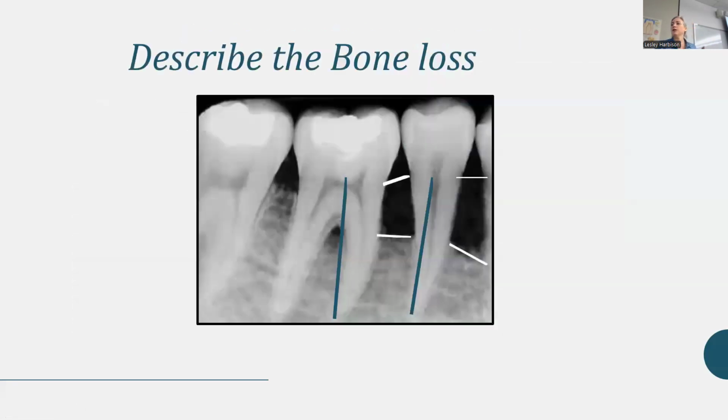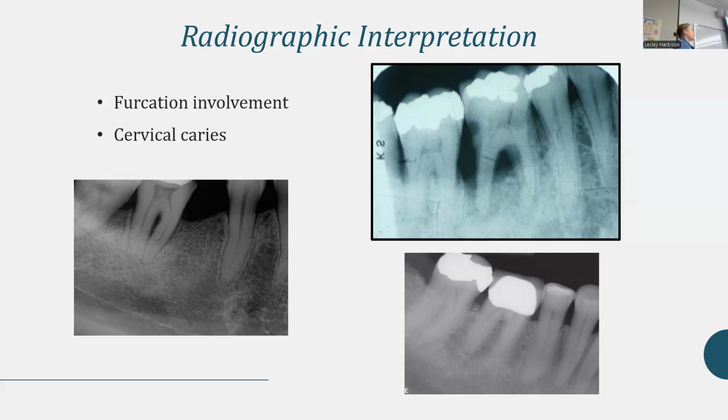Do you classify this as a class 1 furcation? Well, you do when you're in clinic. That's a good question. You absolutely do, and the way you do it is with your probe, really, to start with. If you go along probing and then run your probe in a horizontal sweep, and you feel your probe fall into a curvature just barely, then it's a class 1 furcation. But if you feel like you're going in any kind of depth, then it's class 2. But you can't tell that really from a radiograph. So we don't really classify furcations at all in this class, but you will for sure.